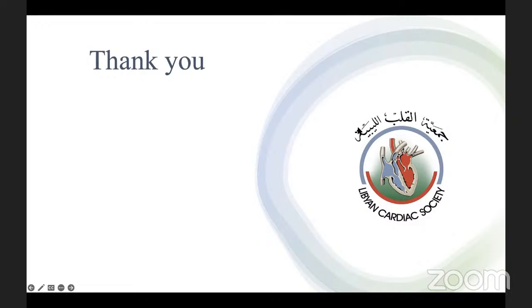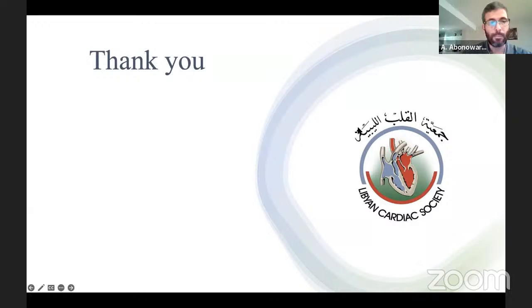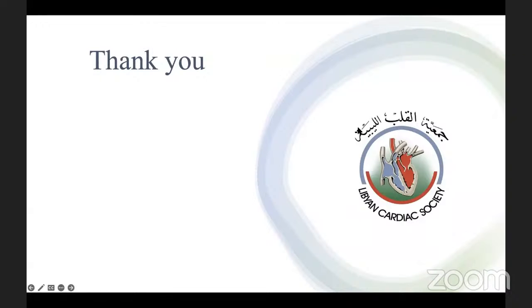And when you are inside the chamber, the balloon should always be up, so you avoid causing any irritation to the ventricle or the atrium and causing arrhythmias. Another thing we need to know: when we measure the pressure, we should have a column of water, not blood. So when we measure the pressure, we need to flush. We have a column of water rather than blood, and that gives you more accurate measurements.